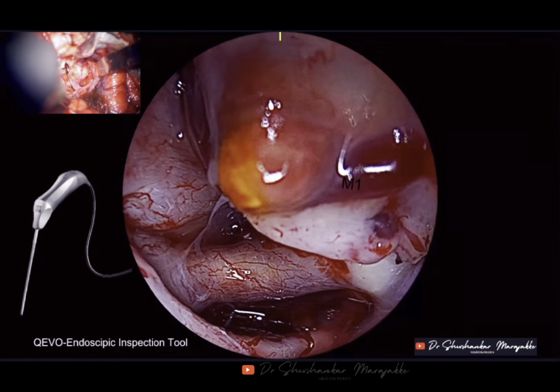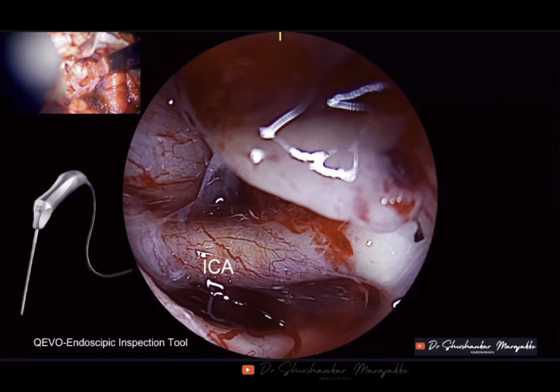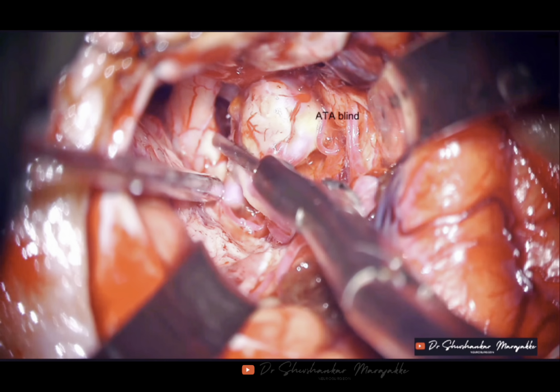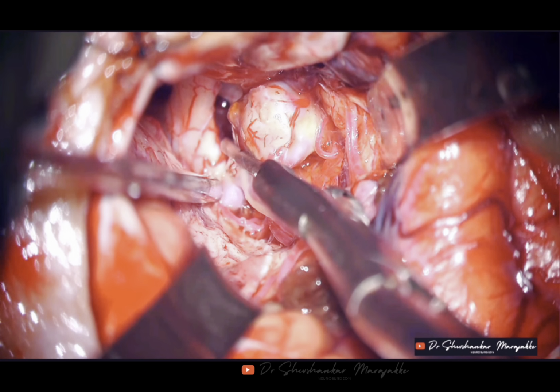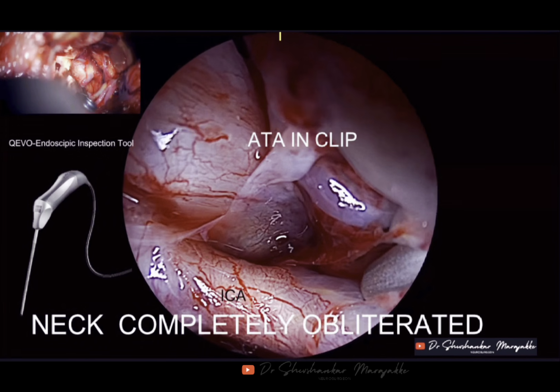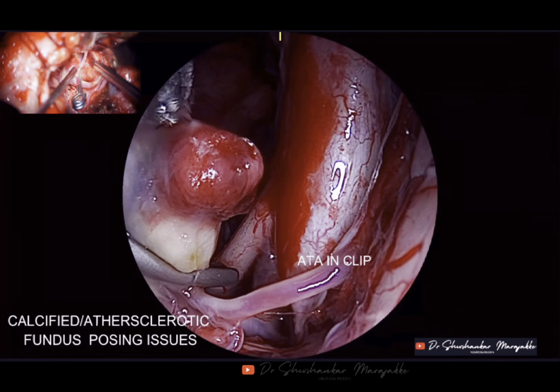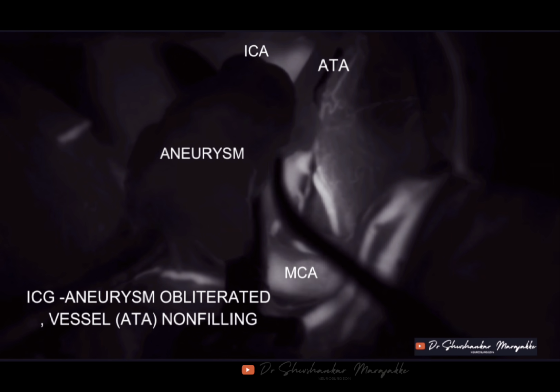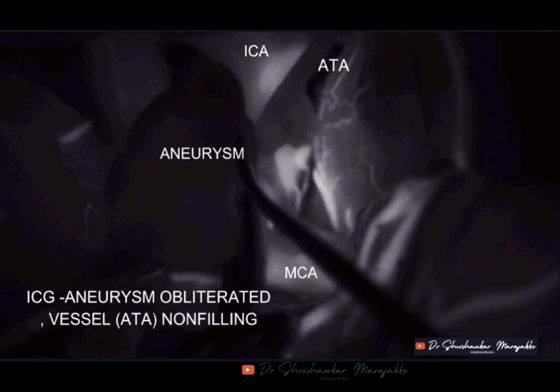Because of the atherosclerotic calcification at the neck, the clip was slipping down, and the anterior temporal artery, which was originating at the neck, was getting included in the clip. So you can see the clip is applied. This is the endoscopic view. The anterior temporal artery is in the clip because there is calcification at the neck, and in this ICG you can see that the anterior temporal artery is not filling, and neither is the aneurysm.